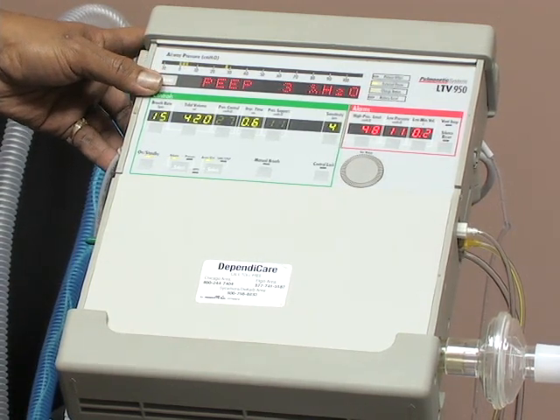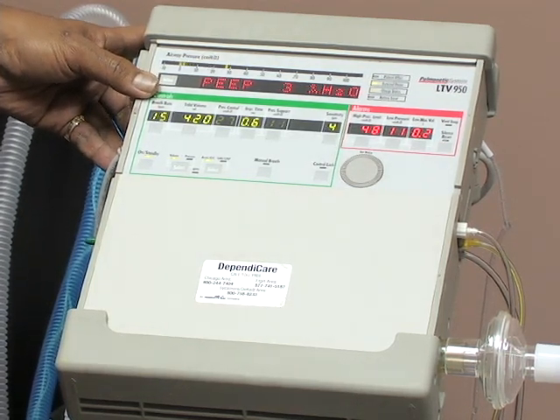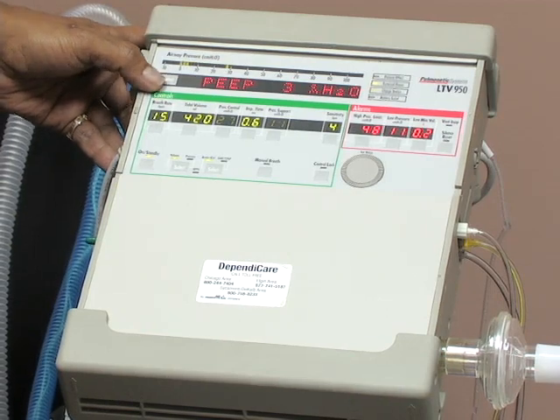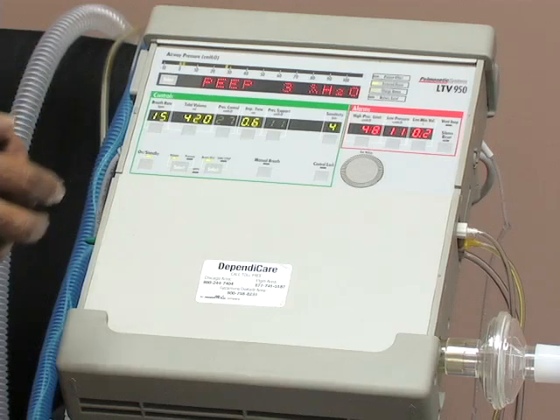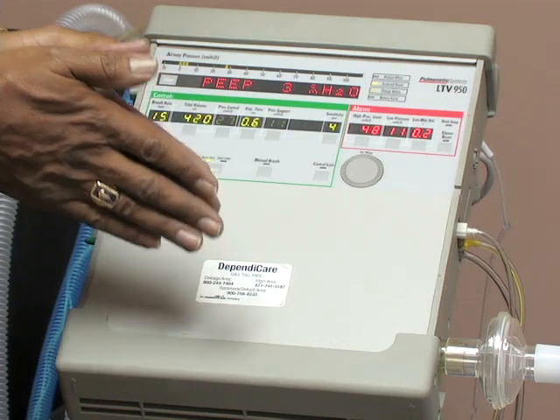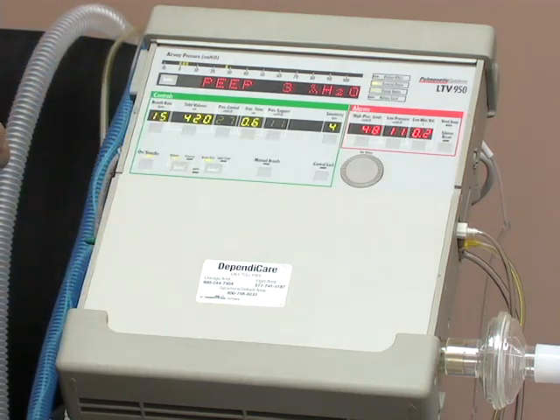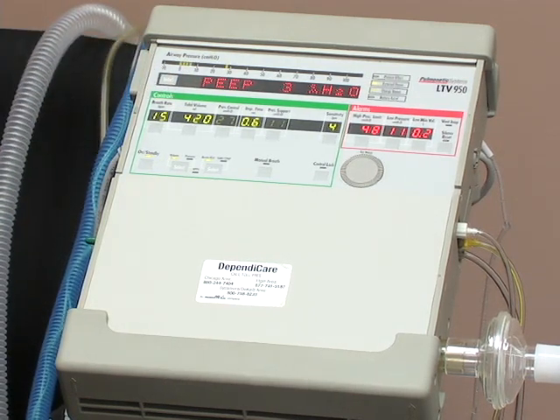Now let's look at our PEEP. PEEP is positive end expiratory pressure. And this is the residual amount of pressure that's left in your lungs after your client exhales. We all have PEEP, and PEEP is very important. It maintains our lungs, our alveoli open. If your alveoli were to exhale and close all the way, they would get stuck together, and you would have a very hard time getting them to reopen. That's called atelectasis, or collapsed lung. PEEP is extremely important. It's normally set at about 5 for most clients.